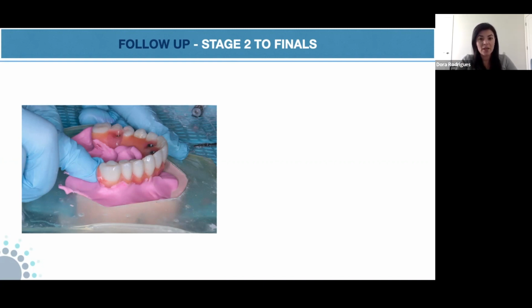have a breakage in the mouth, this model was done from that same position initially. So if you have a breakage in the mouth, you don't want to bring it back to that model, because you're just going to recreate the same tension on that model. So if that happens, you want to make sure that you connect the cylinder or whatever is breaking in the mouth, because the mouth is the most passive place.